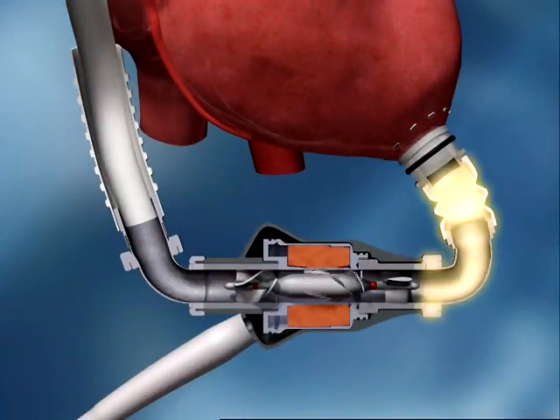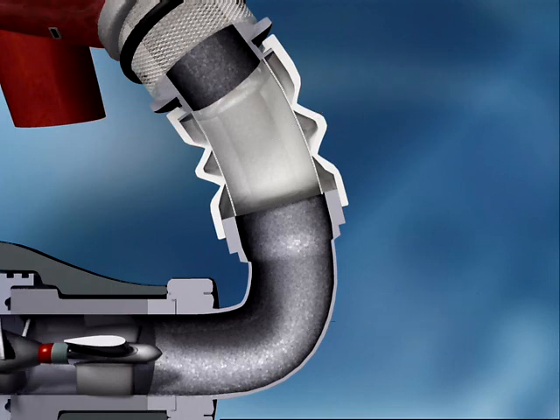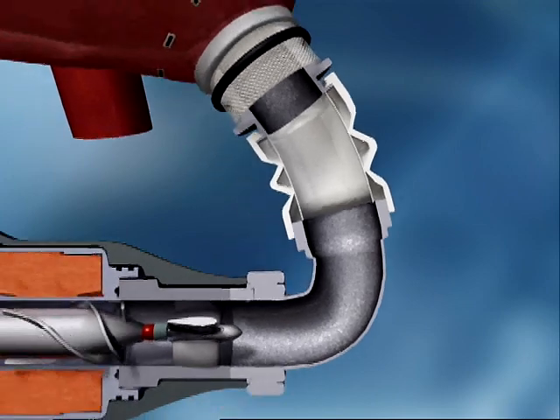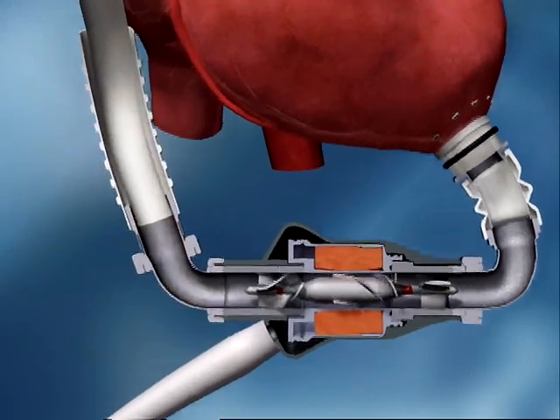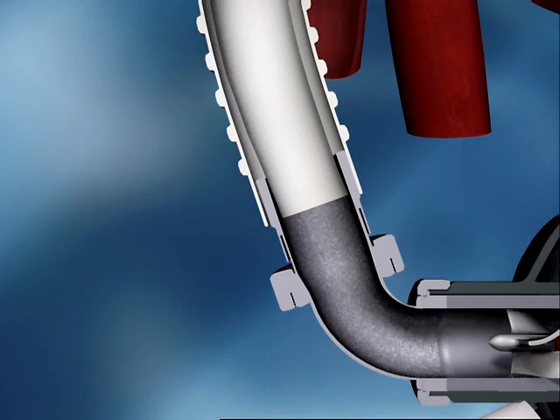The flexible inflow cannula is designed for a wide range of patients, accommodating changes in anatomical position and allowing the inlet to remain centered in the ventricle. Both the inflow and outflow cannulae feature textured blood-contacting surfaces clinically proven on the HeartMate XVE to be thrombo-resistant.